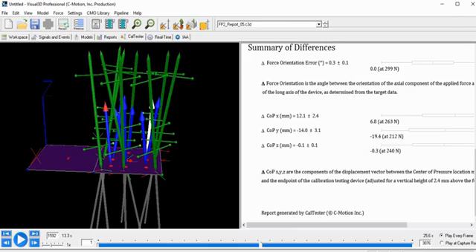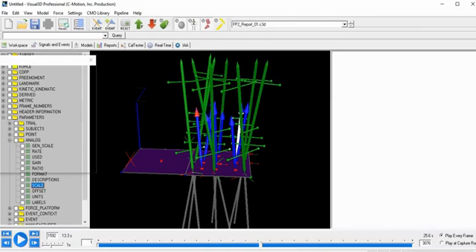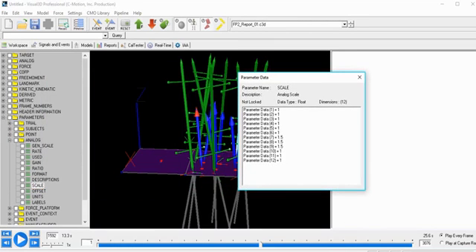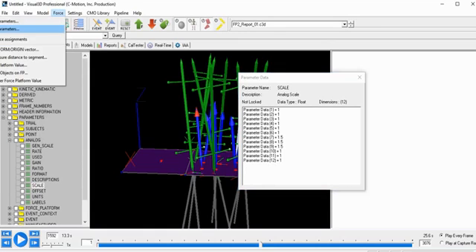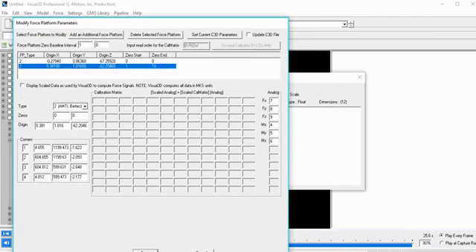You can see your scale factors in the Signals and Events tab, and as long as you have only one file active, you have this Parameters section. Under Parameters, Analog, Scale, you can see here's a list of scale factors. Channels 1 through 12 are going to correspond to your force platform parameter channels. So force, modify force platform parameters, and we're looking at force platform 2. So we're looking at channels 7 through 12.